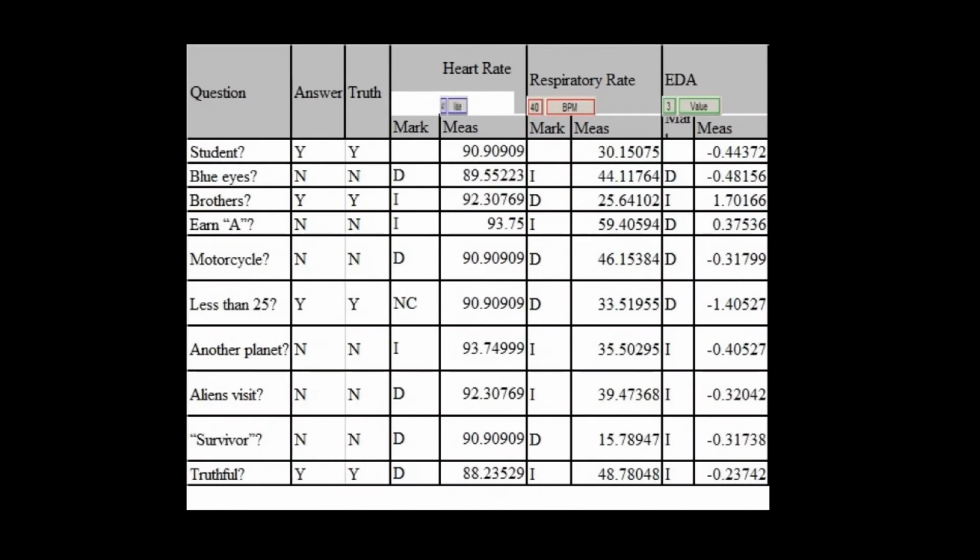while yellow, orange, and red are warm colors, so the EDA would be higher. Third round, we assume that the subject will show a physiological reaction if he is lying. We added 9 simple questions at the beginning of the round, such as his age, position, family background, and so on. After that, we turned to ask a question that was actually different from the simple questions.